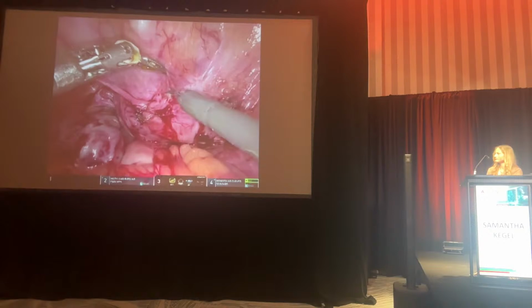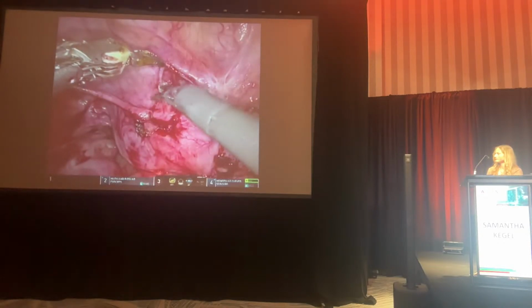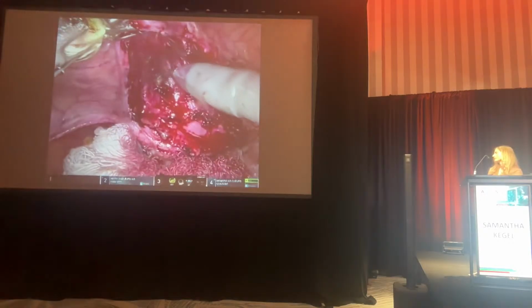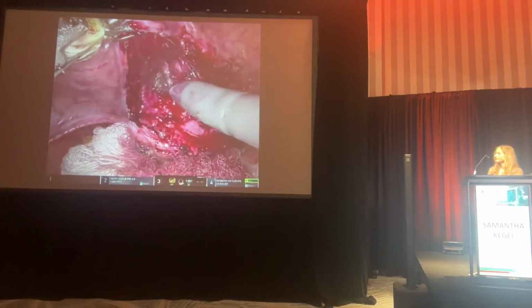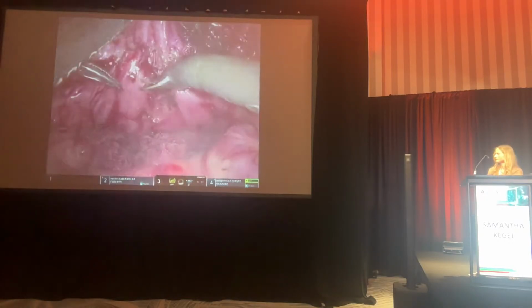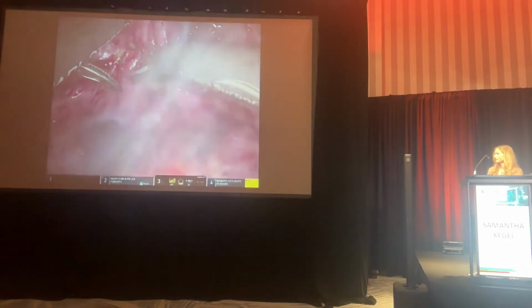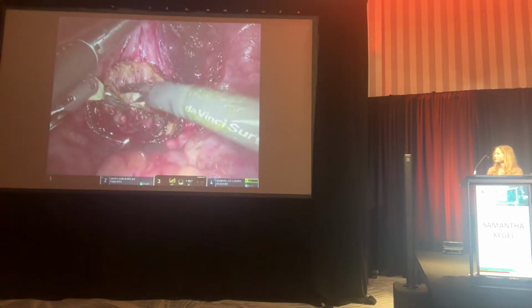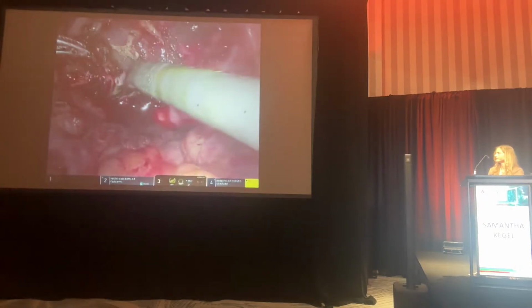The bladder was backfilled to delineate this important anatomical landmark. The bladder was then carefully dissected away from the vagina to provide adequate tissue for revision. The cuff was noted to have multiple areas of fibrosis and endometriosis. These areas were excised with the monopolar scissors and sent to pathology.